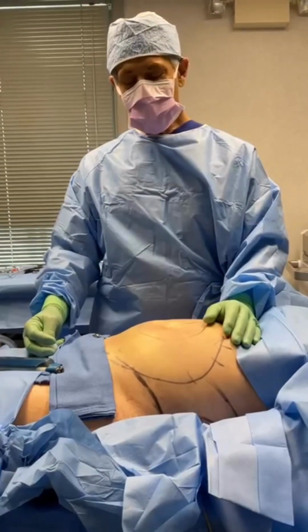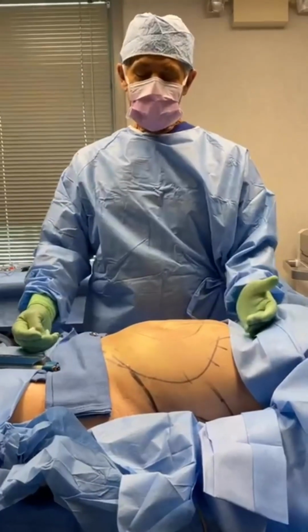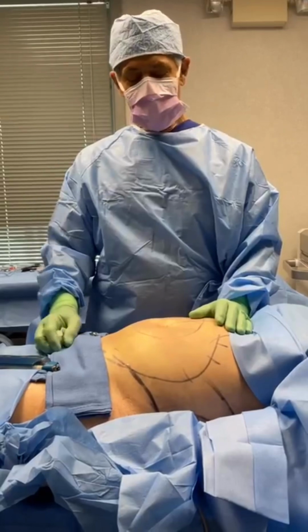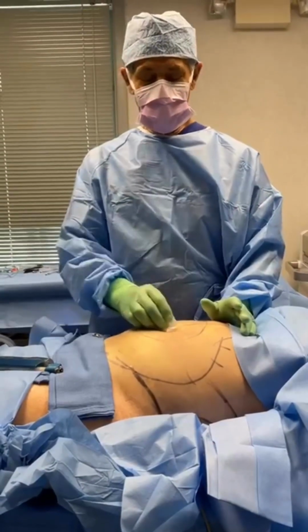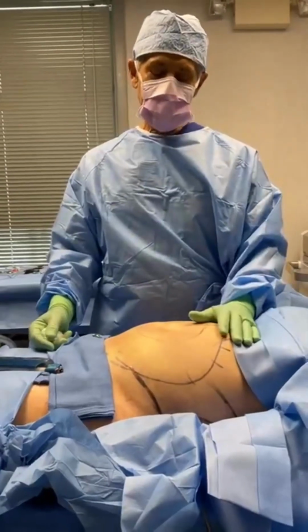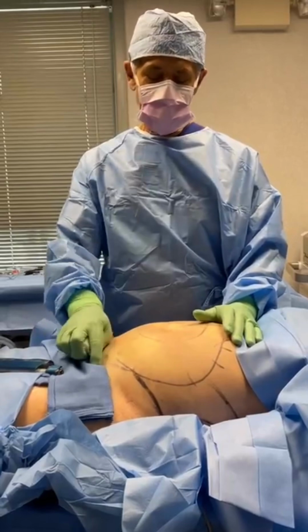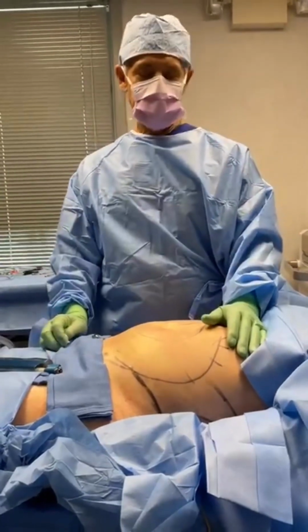And sometimes people want to know how many pounds of fat we're going to take out. It's not about just weighing the fat as we go along and taking out a certain poundage and thinking that that's going to give us the curvatures we want. It's all about making the curvatures, in other words, sculpting, and then when we get done with the sculpting, it's however much fat out that it is.